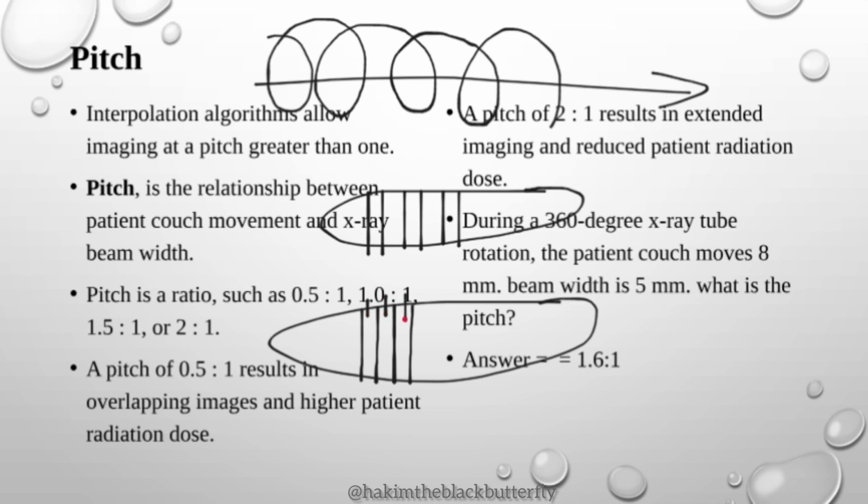They share boundaries. So they are skin to skin. There's not any missing tissue. It means that the table movement and the X-ray tube and the detector rotation are almost comparable. They match each other.